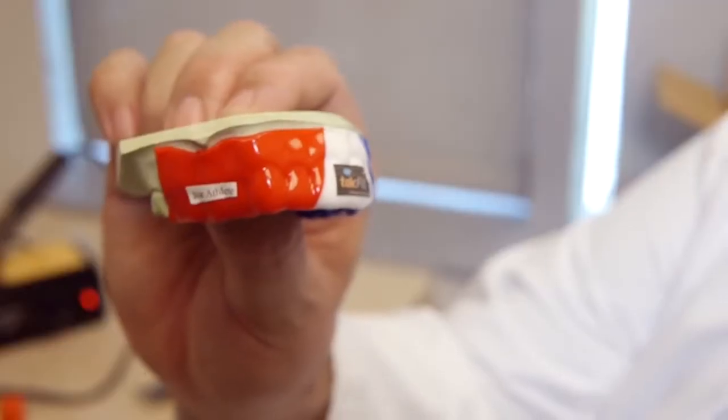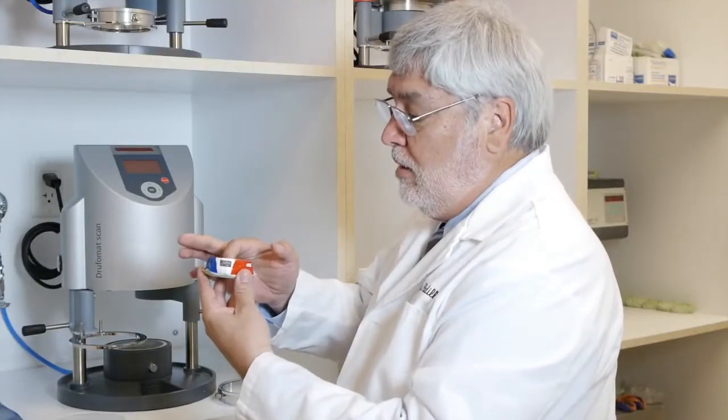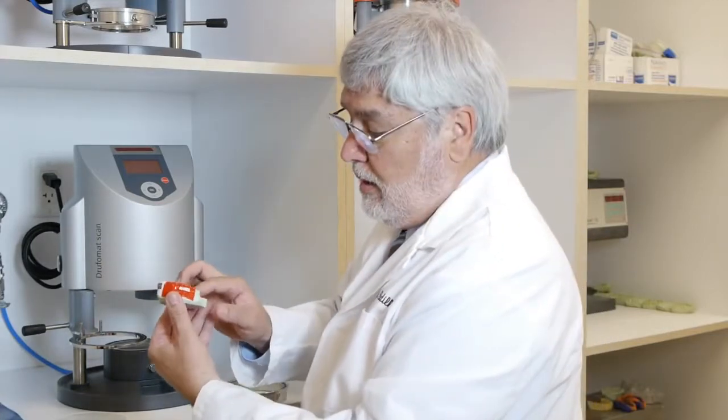The name is placed. Don't do any trimming other than just cutting with a hot knife. You don't want to contaminate the first layer. Make sure your hands are free of any powder from gloves, any oils, any lotions that may prevent the second layer from laminating. Now that our first layer has cooled properly, we've trimmed it to the proper dimensions, and we've placed the logos on and the name, we're ready to start our second layer.